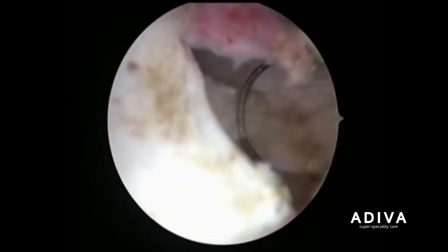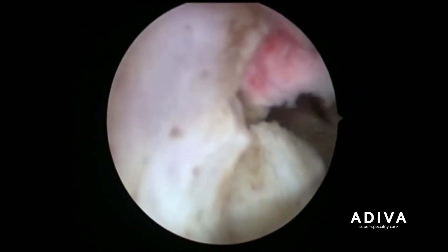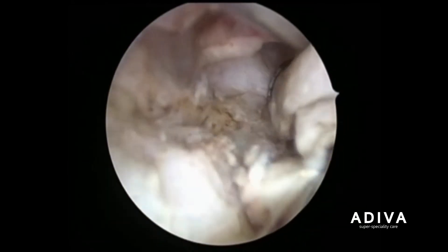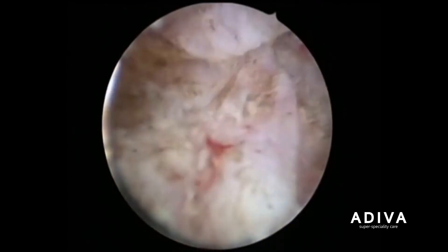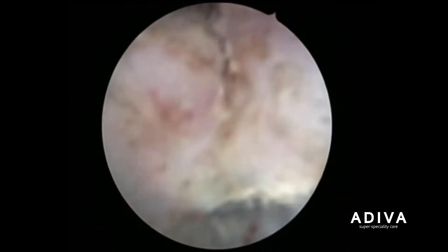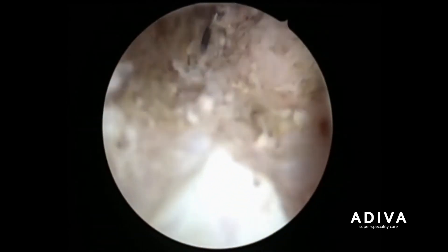This is the part of the adenoma which we have to remove near the valve, which is known as the sphincter. Here is the apical tissue near the verumontanum and here we are removing the adenomatous part.